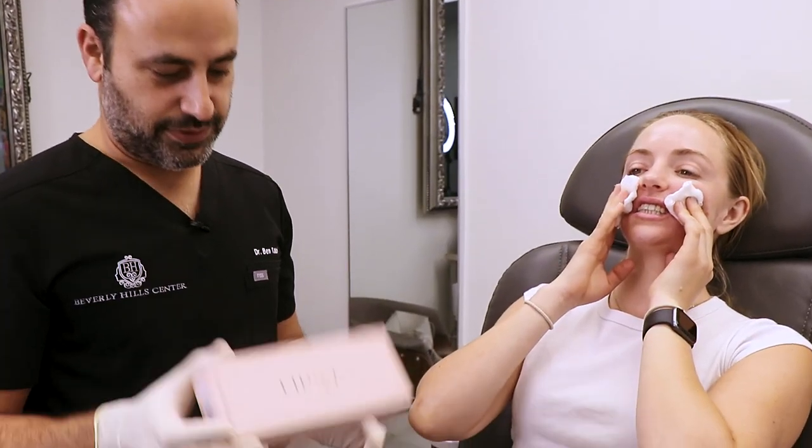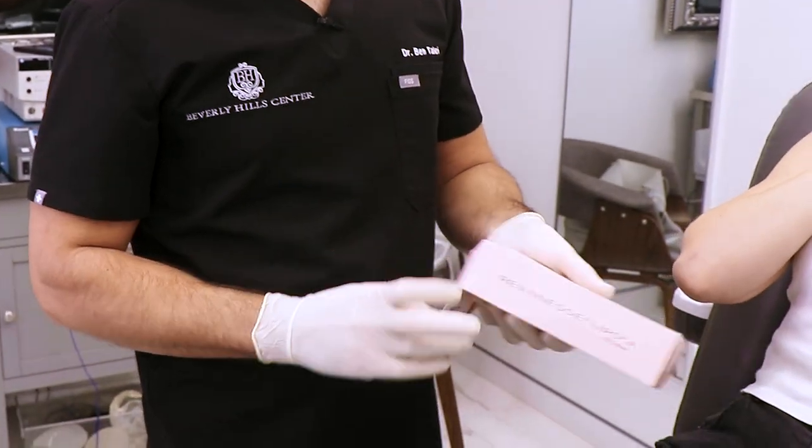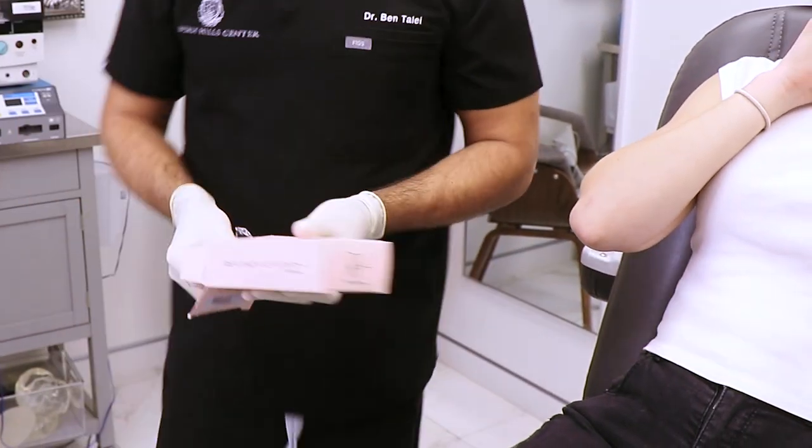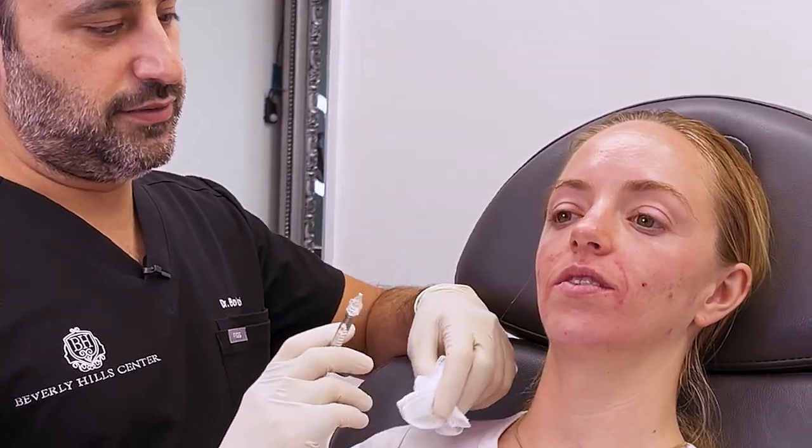Now we're going to do lips — we have Reveness Lips, which is very similar to regular Reveness Versa. Nice thing about these products is that they're smooth and go into the lips nicely and easily. The key with lips is not overdoing it. Always prime your own syringe so you can feel the pressure it takes to push up. If you look at the lip, there are different areas.